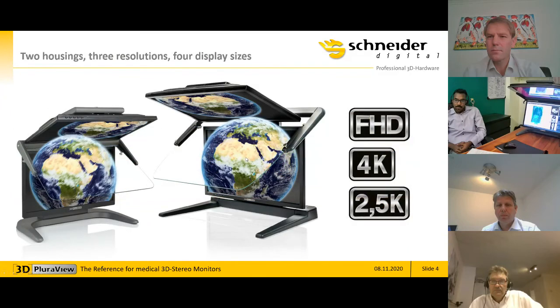They are available in two sizes. On the left are the 22 and 24-inch models, which are very compact. On the right-hand side are the 27 and 28-inch models, which are also available with the VR tracker, so they are fully VR compatible. The bigger ones are ideal for group presentations and group viewing. The smaller ones are, of course, perfectly okay for individual work on the desktop workspace.